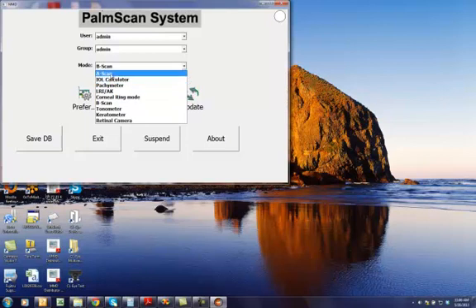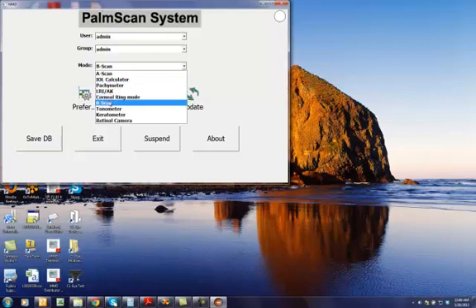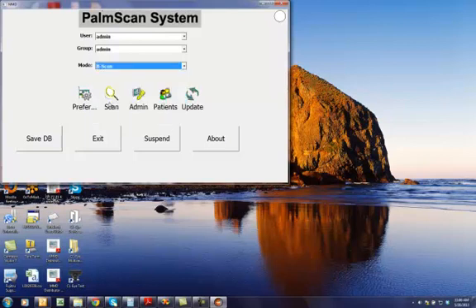So, the A-Scan and Pachymeter are the original devices that were available. Now we have added the B-Scan option. With the B-Scan option, you now need to plug the probe in, in order to be able to do the scans.